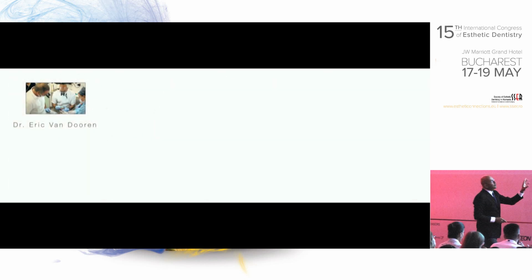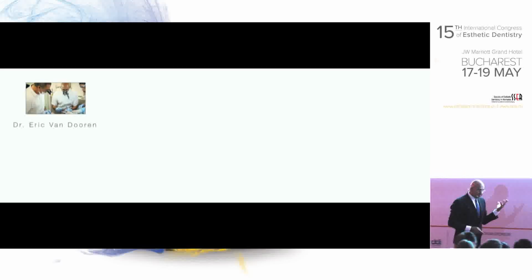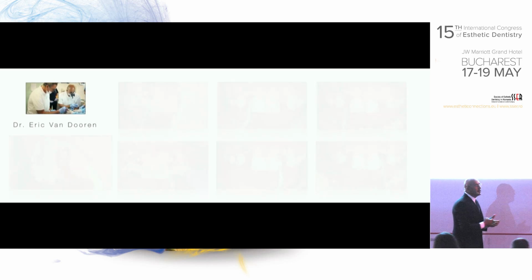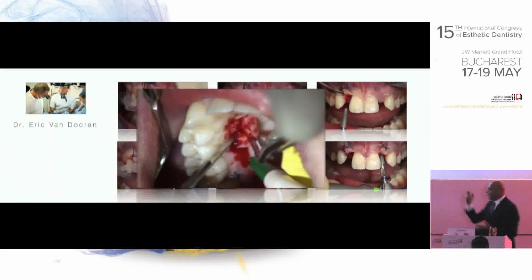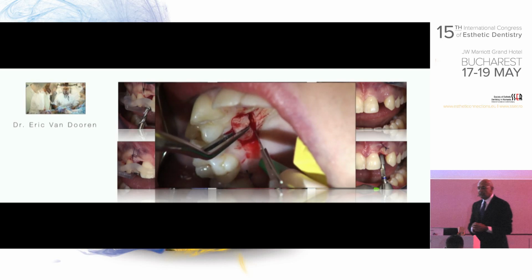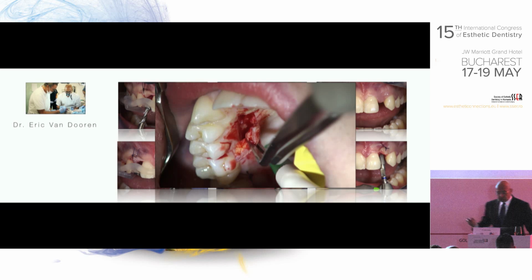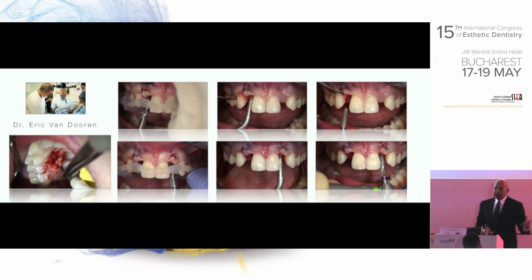So this is what we do before surgery. And in surgery, you had the chance to listen to Eric and Florin yesterday. Eric starts the surgery with a soft tissue graft that he takes from the palate of the mouth. We have amazing periodontologists and implantologists in the lecture circuit here. I don't want to get into detail. He knows what he's doing.